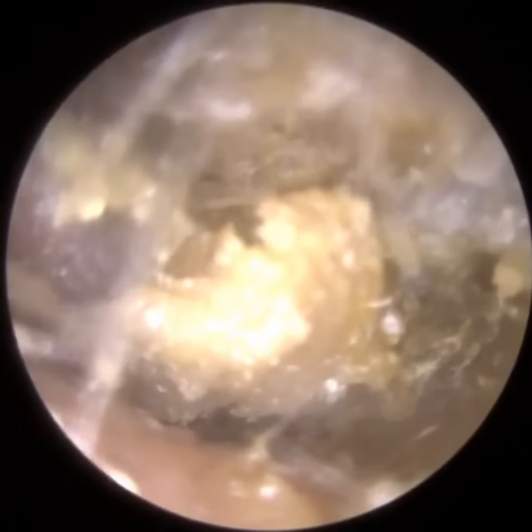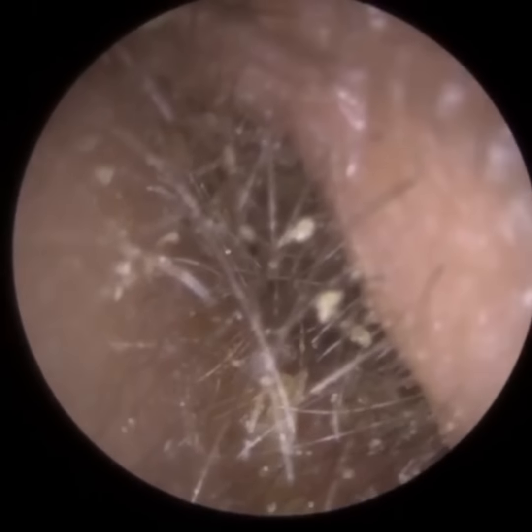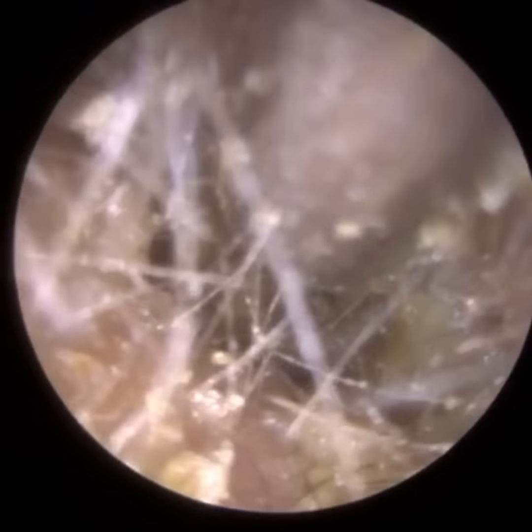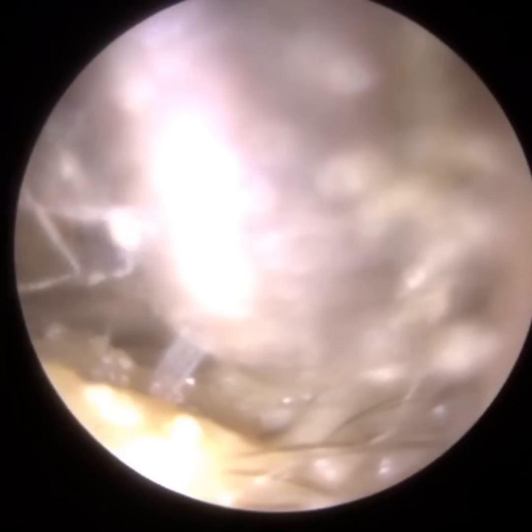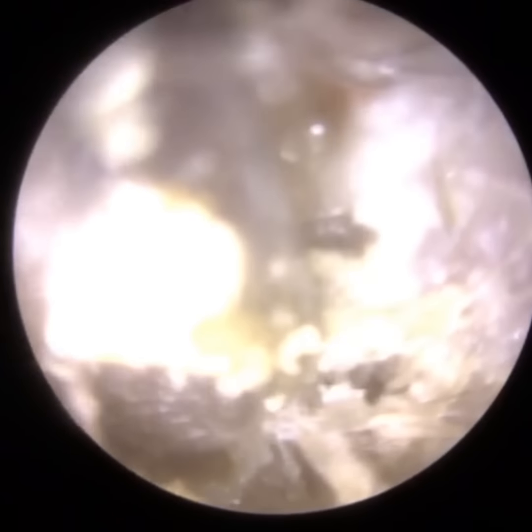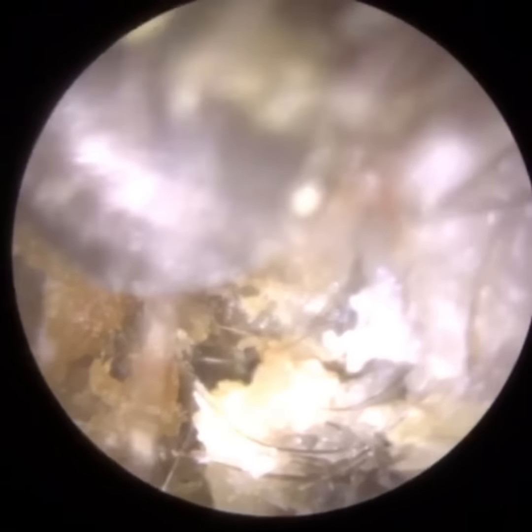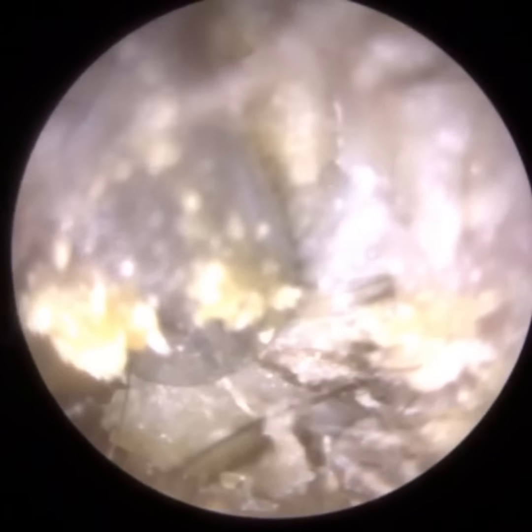And so the patient has got Keratosis obturans, but they've also got an infection, there's a bit of otorrhea discharge. The ear canal is also inflamed and swollen. So I'm just using microsuction near the entrance, trying to clear the lateral debris. There's infected debris as well, so it's not only a skin plug, but we've got all this debris due to the infection. We're just slowly but surely clearing that away near the entrance.